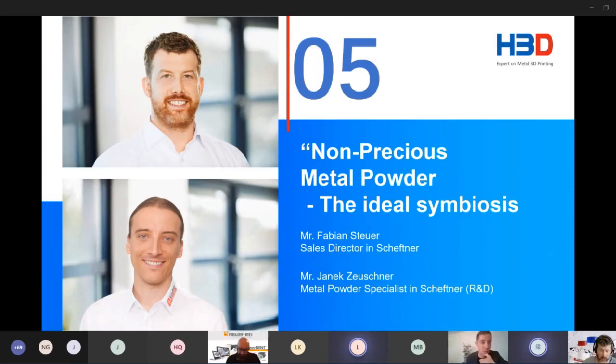I just also want to draw the attention, finally, that all the AM process is just in symbiosis, as I said in the presentation. You will only receive good results if the machine manufacturer and the software fit together with the metal powder and the post-treatment process. So this is why all the four factors have to work together hand in hand, and you cannot just replace powder or replace software, use other settings, or build up another layer thickness. All these external influences affect the final workpiece. And mostly people think they make it better, but they make it worse. All right, I think this is the triangle of printing. If you want to have nice prints, you need compatibility between software, powder, and the machine design.